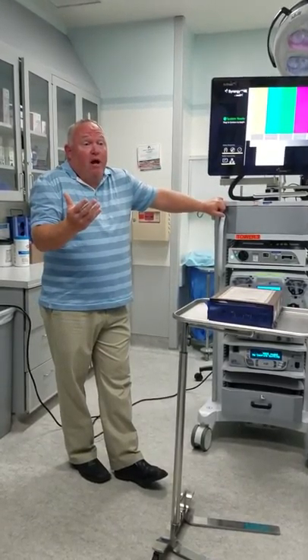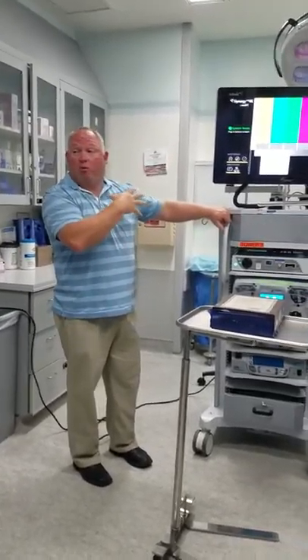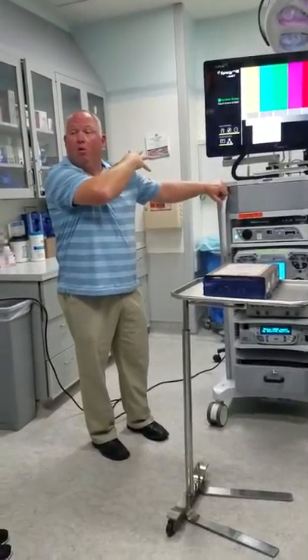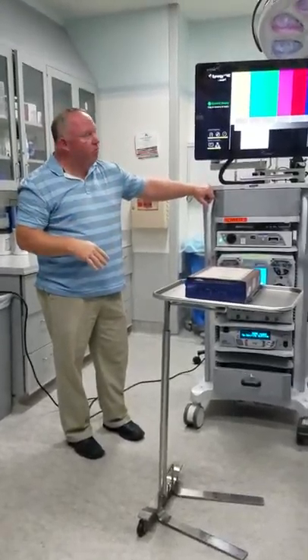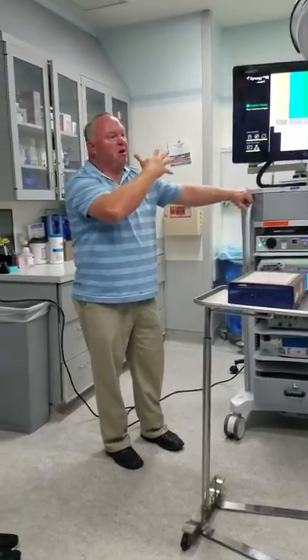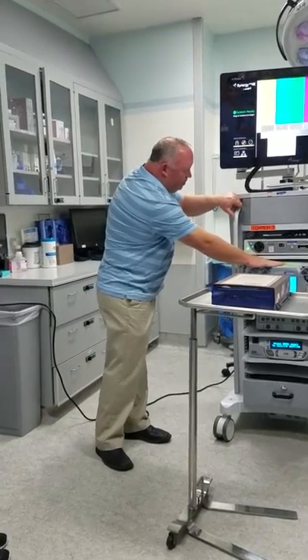Problem with that is, make it too high, even though you have a capsule, you are going to leak some fluid out into the sub-Q tissue. You see a shoulder scope when it's all done, the shoulders are humongous, with holes on one side. It's just full of fluid. It's always normal saline, which is what's in your normal body anyways. Eventually you get rid of it, but it looks humongous for a while. It leaks a lot of water. So this is a pump.